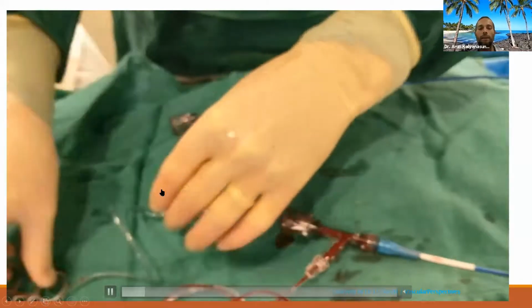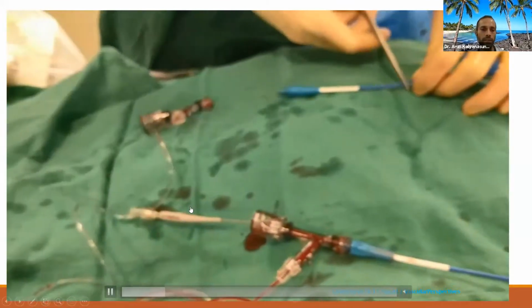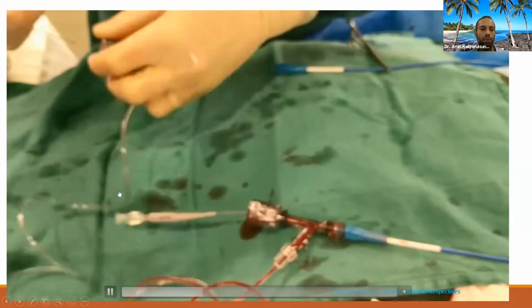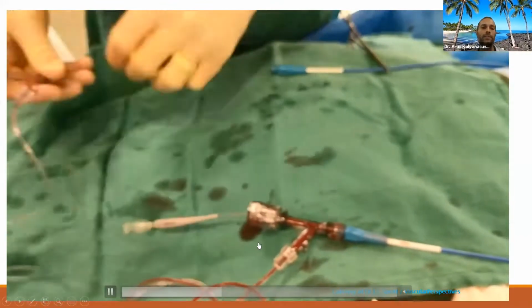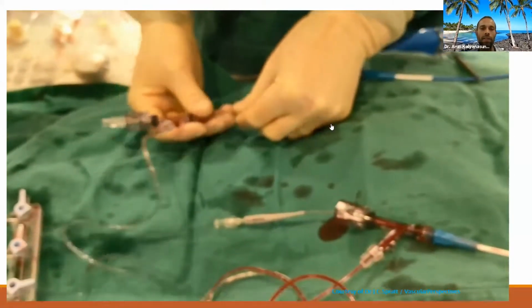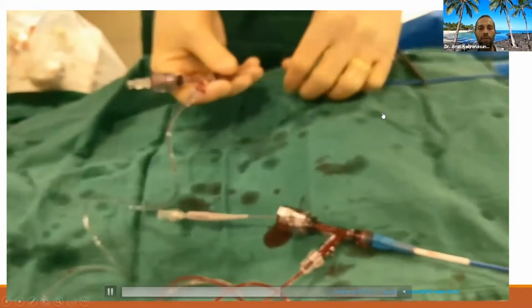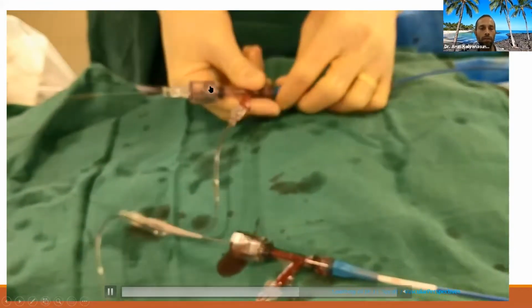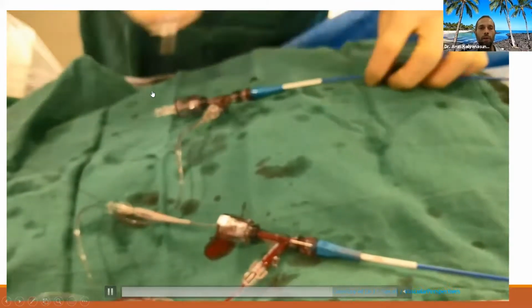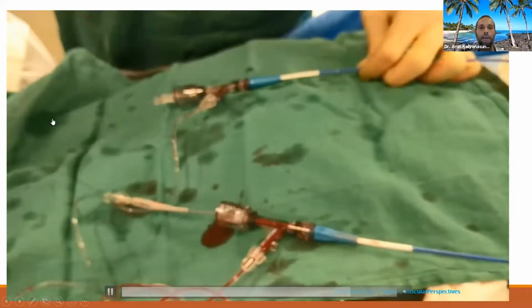So typically what you do is, and again, this is actually courtesy of James Pratt. I think I did thank him for that. I mean, we've all done this. That's actually a Turnpike catheter, which we don't have in Asia yet, at least in South Asia. So as you can see, you have it all set up, advance the wire, load the wire over this way. And now you have a wire going in like this, all the way through the heart, back here and out here, right?